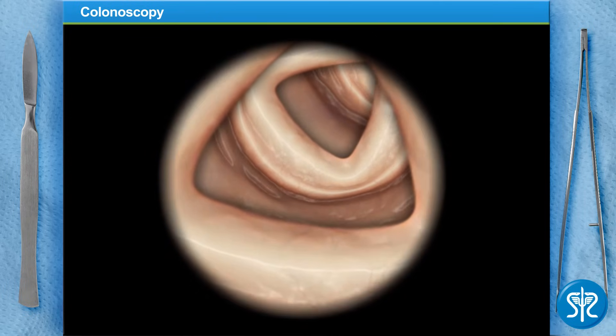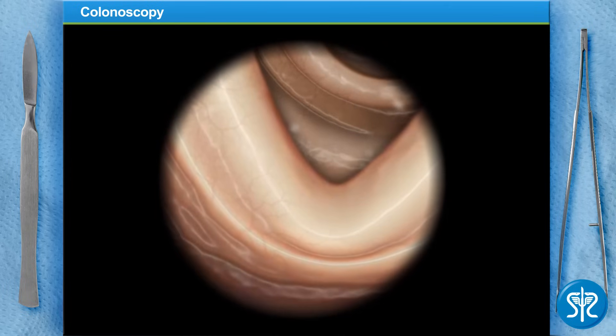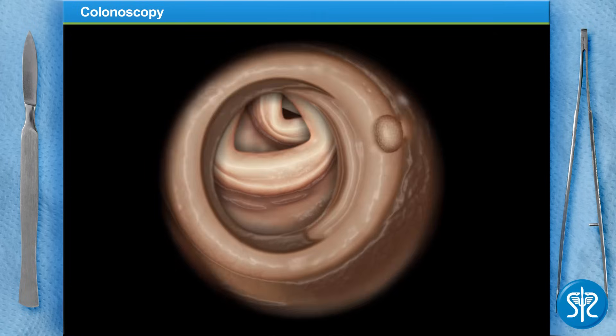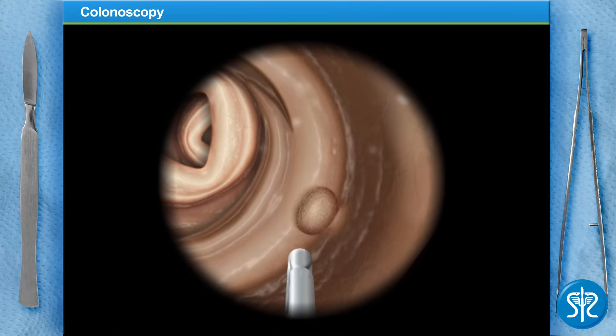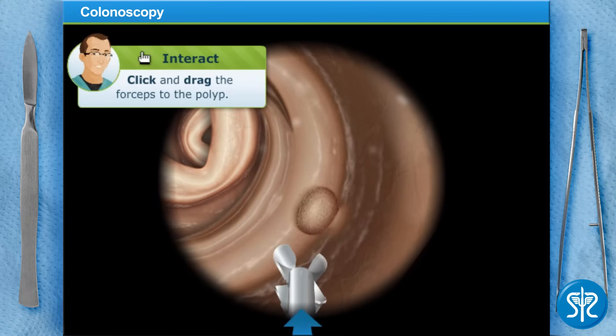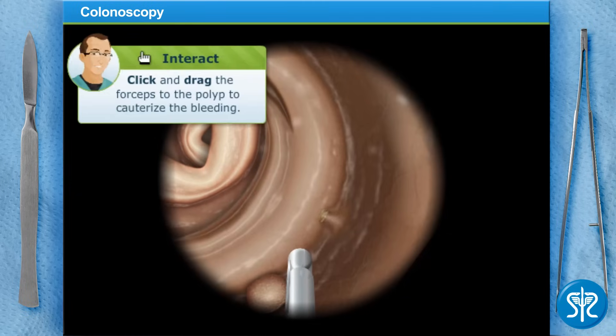Let's move into the transverse colon. We've got a small polyp in the transverse colon — we'll use the forceps to remove it. Fine work. We'll need to remove the scope so we can bring the polyp out. First, let's use some heat to cauterize the spot and try to stop the bleeding.